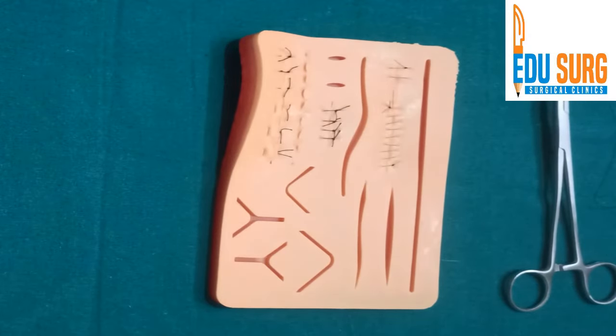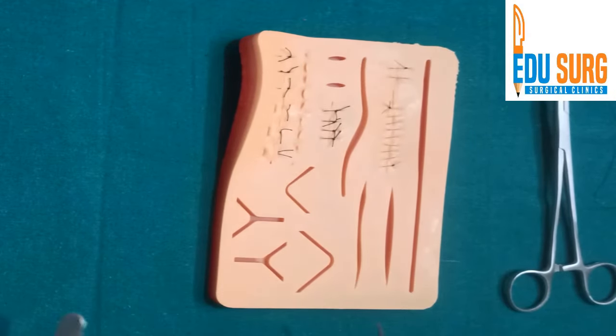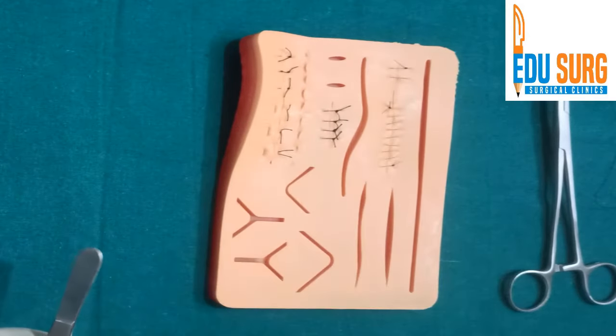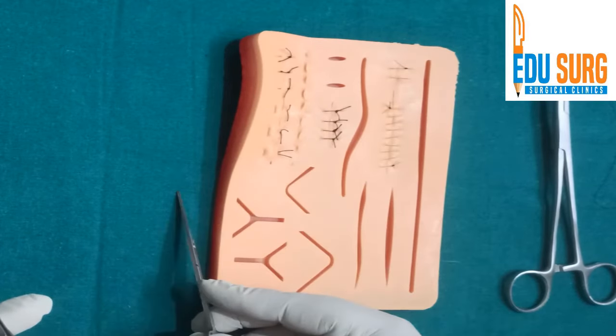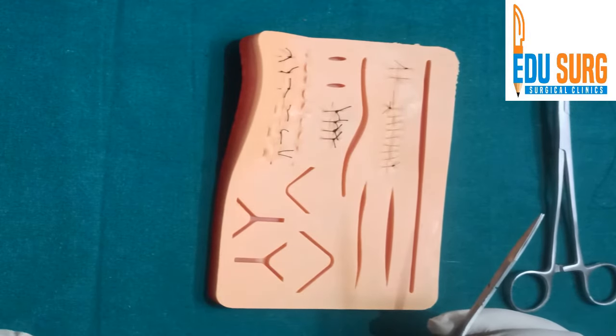The removal of stitches is an important process — it's not something that you just cut across. The key principle is to avoid infection even while removing the stitches. This surface is exposed to the atmosphere, so when you are removing the stitches it is very important that this surface does not go inside, and at the same time the entire suture comes out.